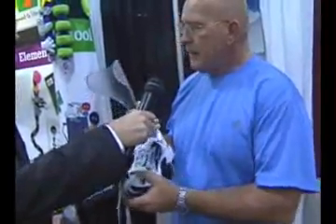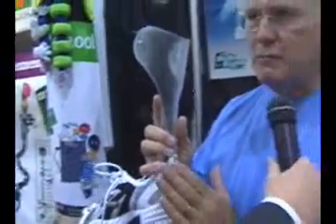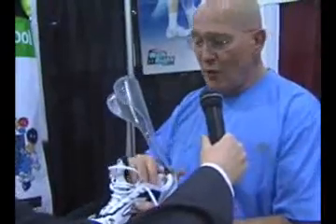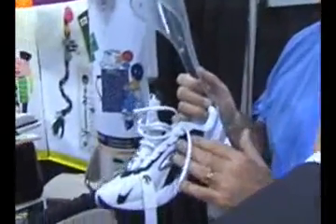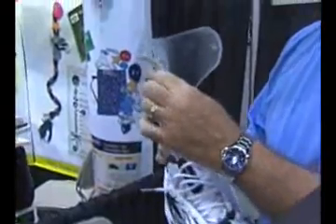What we have done is take the brace and attach it externally onto the heel of the shoe. One of the wonderful features this immediately presents is that when a person buys a pair of tennis shoes, they get to enjoy the nice, soft cushion of that tennis shoe. They are no longer walking on a hard piece of plastic.